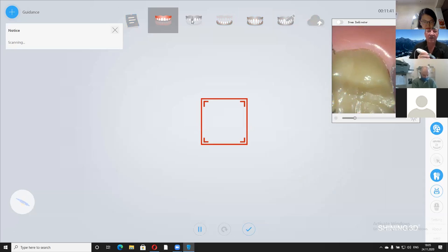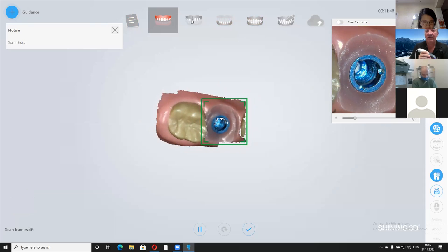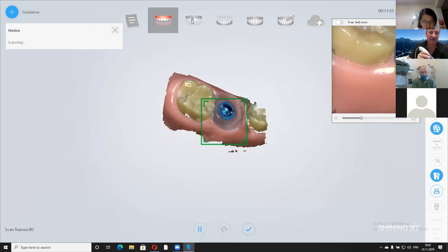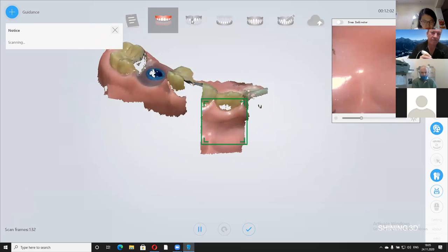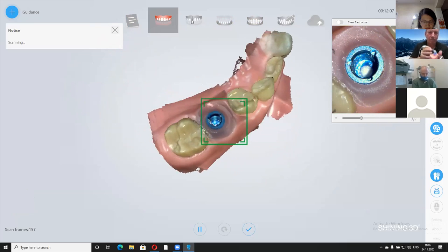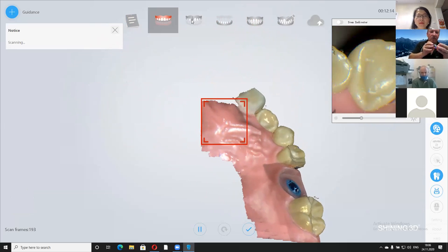A little patience. Normally, when the dentist scans it, the hole here where the implant is, there's maybe a healing cap on it. Or maybe the healing cap is also taken away like you see here, okay? So basically you just go left and right. We get the contacts better on there, okay. Let's say we only do half a jaw.